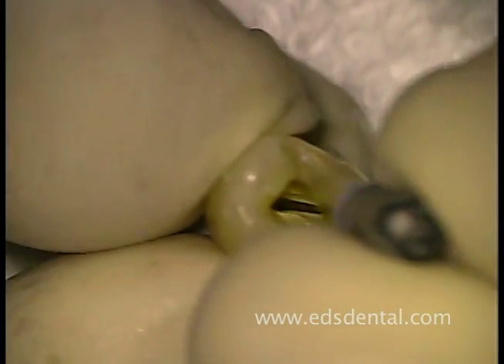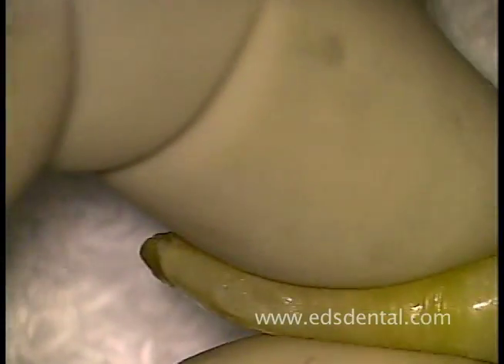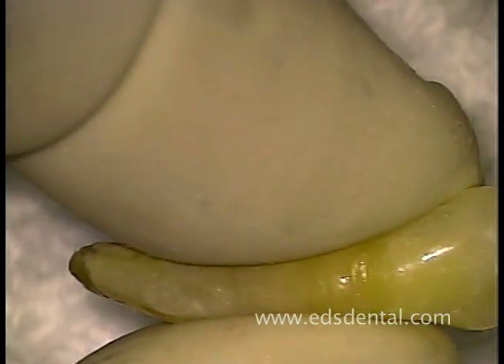I am now using a 25mm 08 reamer to probe the buccal and lingual canals to the apex. For the sake of this demonstration, I am purposely exiting the canals apically to assure patency.